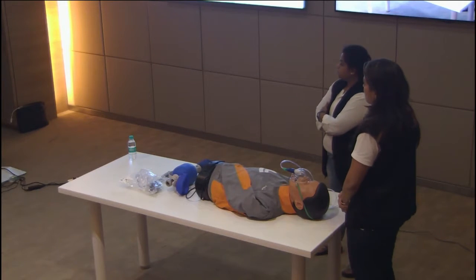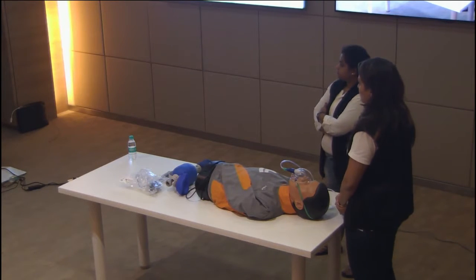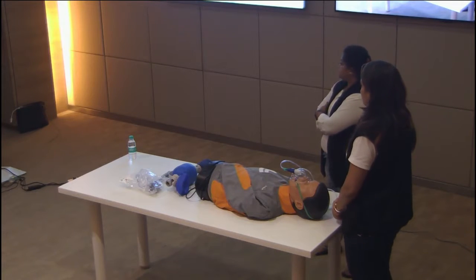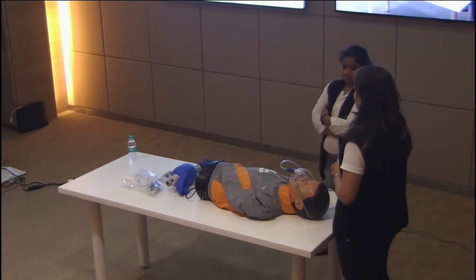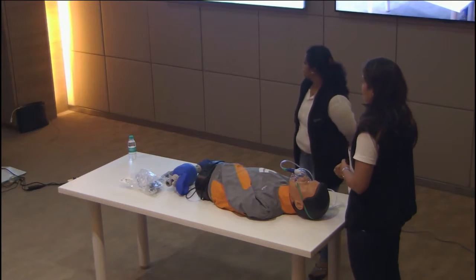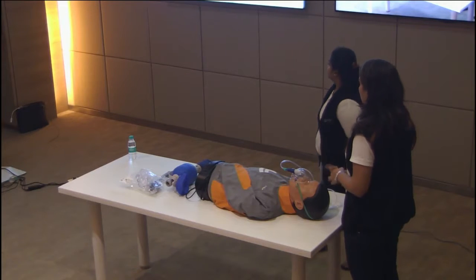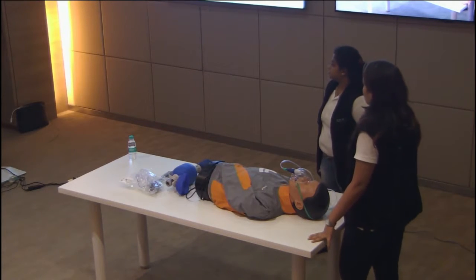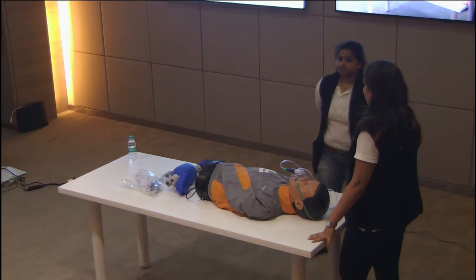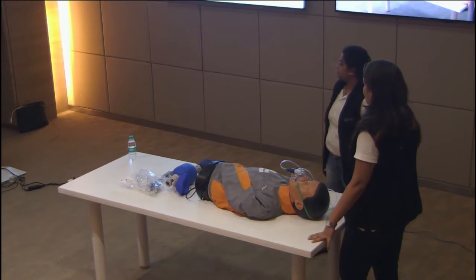So yes, Dr. Paulomi decided to put an NRBM, and both the doctors hoped that the patient's saturation would possibly come up. So let's see what really occurred. Now the frustration levels are creeping up. The patient is on an NRBM. The saturation is still less than 90, and now his respiratory rate has gone somewhere close to 50. So there we have a problem. We have a patient who's come in with a nasal cannula. They were actually just sitting and they thought that maybe we just put a nasal cannula and they'll be fine. They started a mask. The saturation didn't pick up. Then they went on to an NRBM. It still hasn't picked up. Now, what do you do next, Dr. Paulomi?